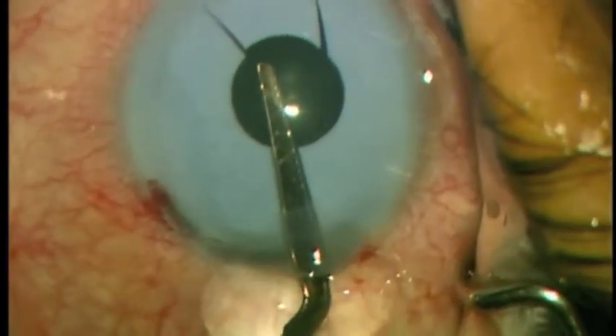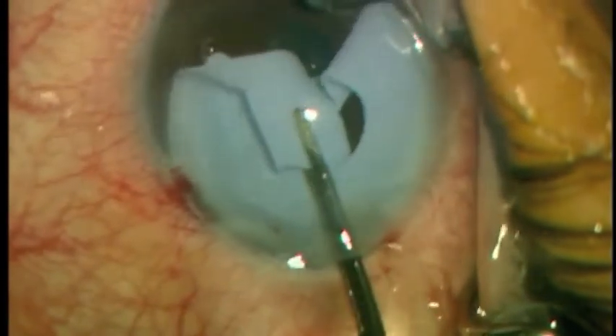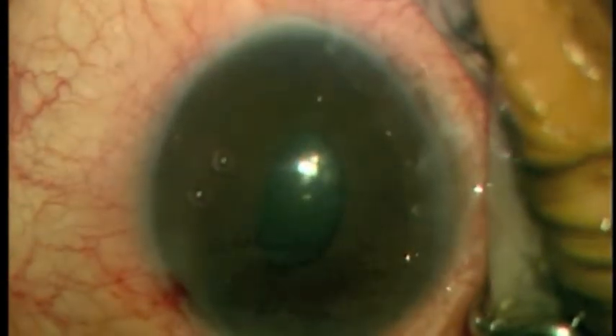Intraocular forceps are then used to grasp the flap in the implant, and the implant can be gently rotated out of the incision.